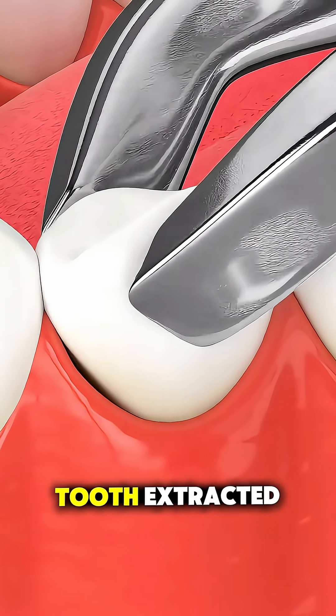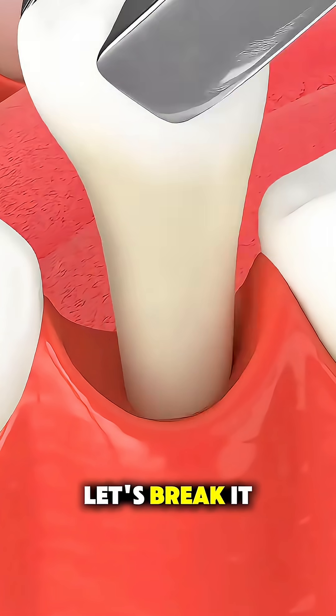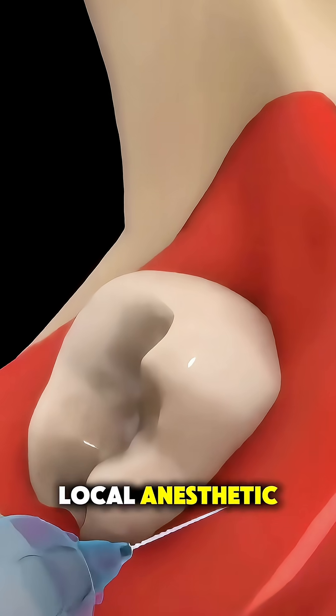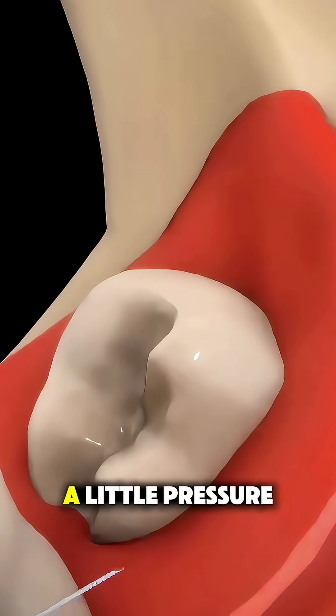Ever wonder what really happens when you get a tooth extracted? Let's break it down. First, your dentist will numb the area using a local anesthetic so you don't feel pain — just a little pressure.